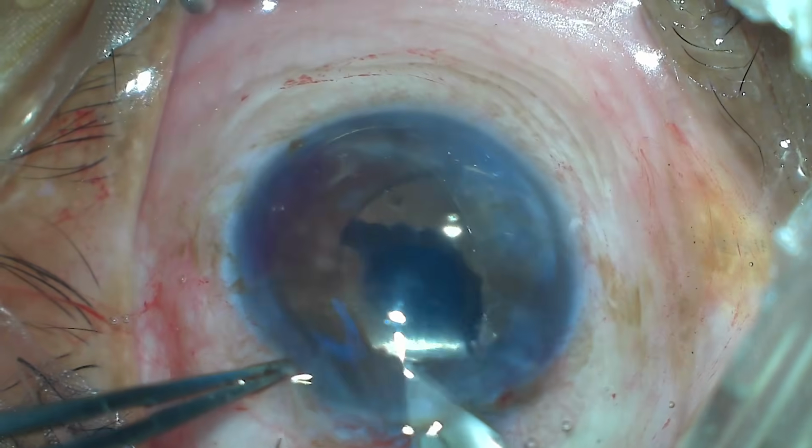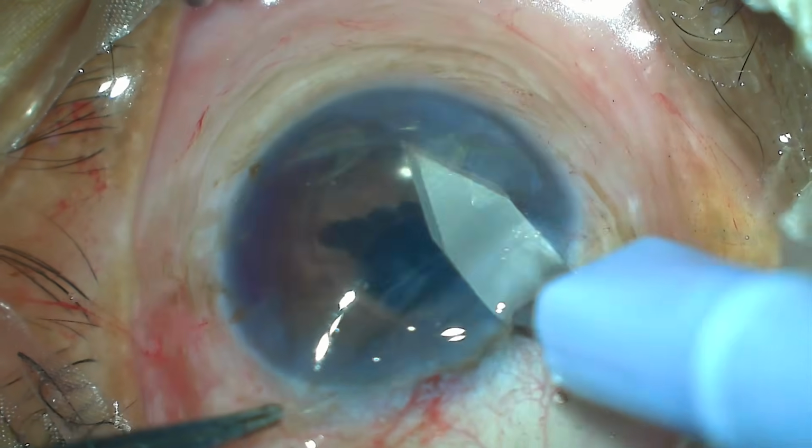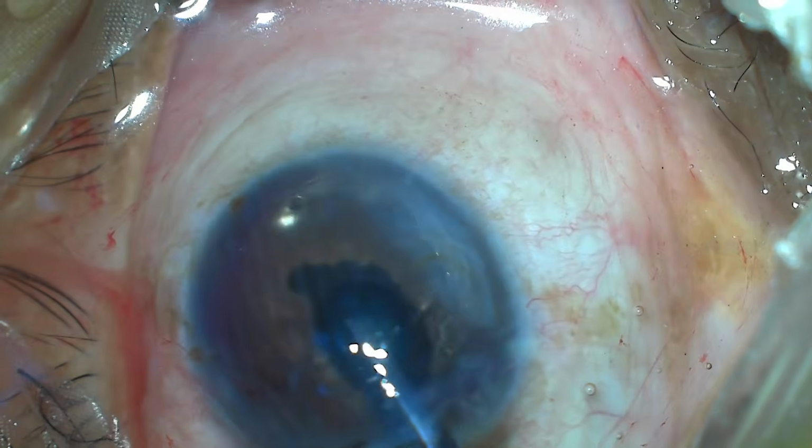Now the incision was further increased to remove the whole optic along with one intact haptic. Although it wasn't the original plan, it was the safest path forward.